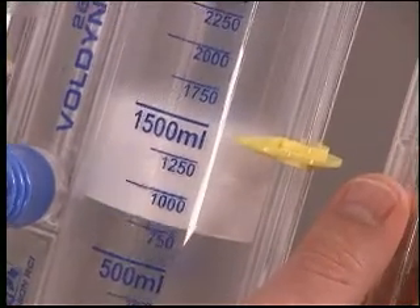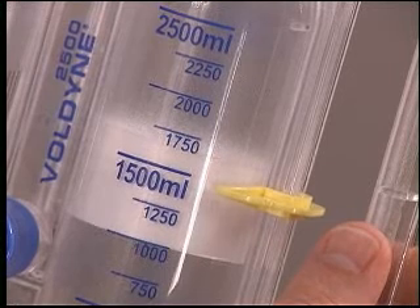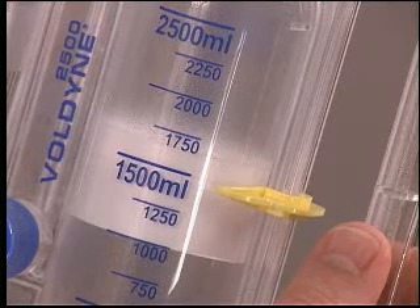Watch the piston rise and note the air volume number. If you practiced before surgery, work towards reaching the goal you set. When you cannot inhale any longer, remove the mouthpiece and hold your breath for as long as you can. Relax and exhale normally. Try not to force the air out.